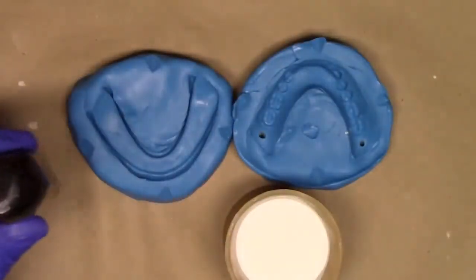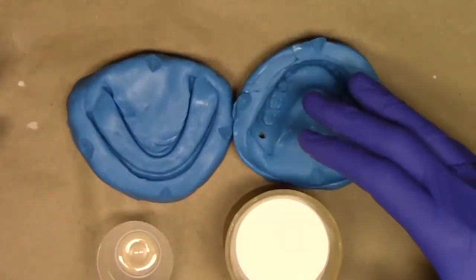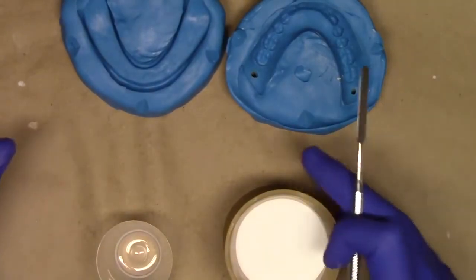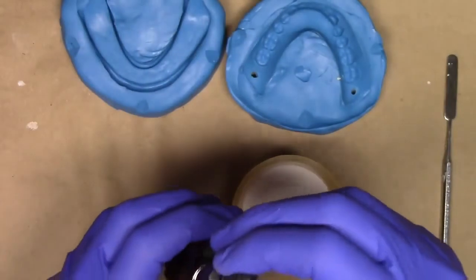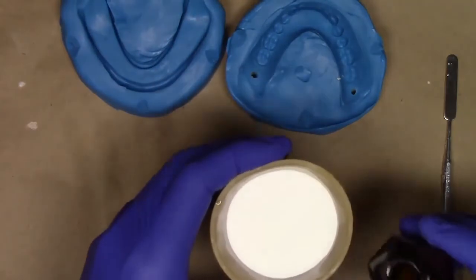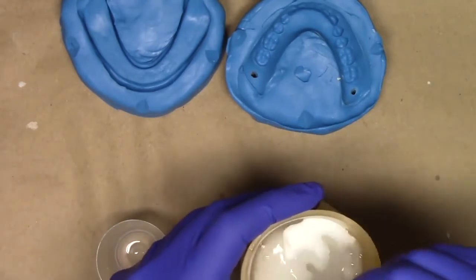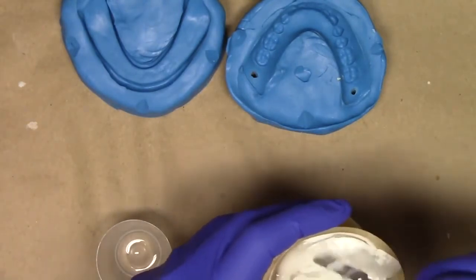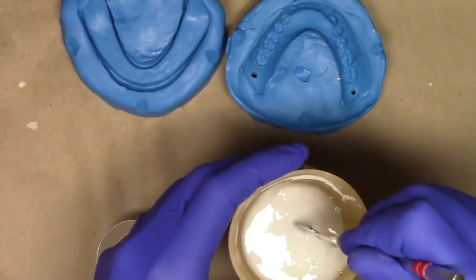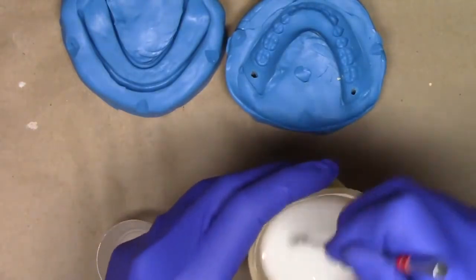Step one is we're going to go ahead and take a little bit of monomer just into one of our dappen dishes just to give us some liquid to work with. I'm going to set aside my putty just for a moment while I go ahead and start mixing. Now it's going to look like I'm over mixing this material as well as putting in too much monomer. This material, you want it to be nice and runny. And applying our liquid monomer just arbitrarily until it's almost like a soup-like consistency.